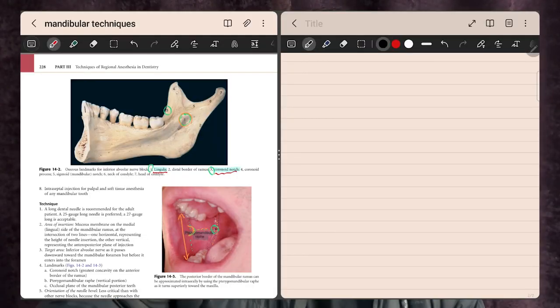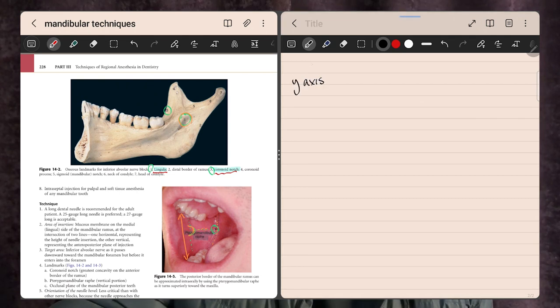To perform this, get the patient to open their mouth wide. With your free hand — the one without the syringe — dip into the depth of the vestibule. If targeting the left inferior alveolar nerve, use the left thumb or finger to dip into that vestibule, retract back, work your way to the external oblique ridge — a bony landmark — and then up to the coronoid notch. This fully palpated coronoid notch becomes your y-axis for the IAN technique.